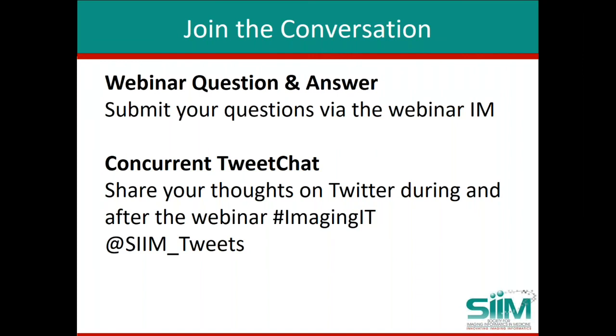Well, Spark is all about integration, and you can integrate it if you send FHIR to it. So any FHIR-enabled system will be able to integrate into Spark. And if it's not FHIR-enabled, you can use the Fire.net API if you're a .NET system to make it FHIR-enabled. There are also comparable libraries for JavaScript and for Java.